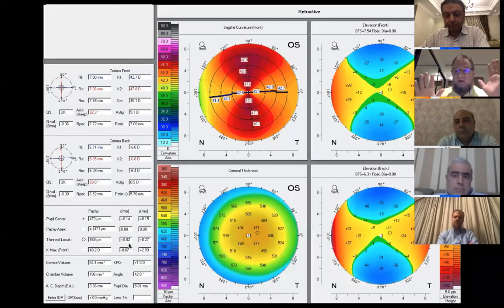So we cannot guess actually until we put all the information in the device, and then we will calculate on the machine. If we are planning for wavefront or topography guided or ocular wavefront, the calculations will be on site, on the machine itself. We cannot apply the same Munnerlyn formula, which is, for example, 13 microns for a 6 millimeter zone, or 15 microns for 6.5, or 17 for 7.